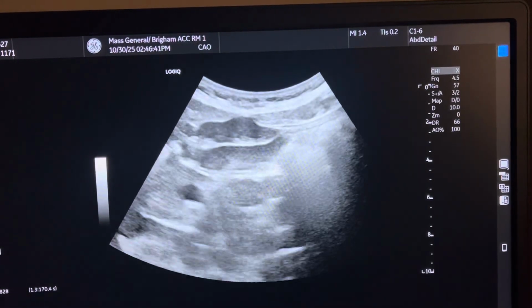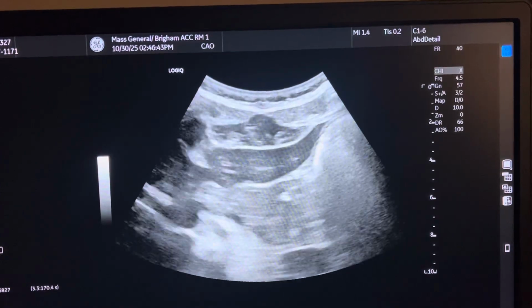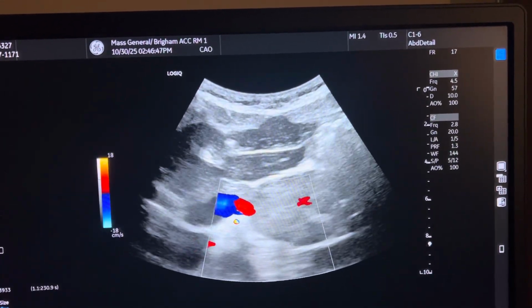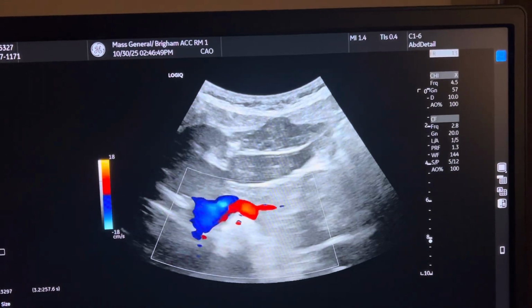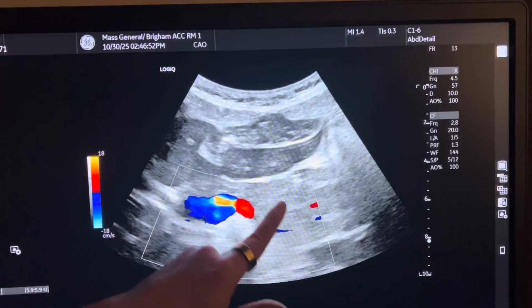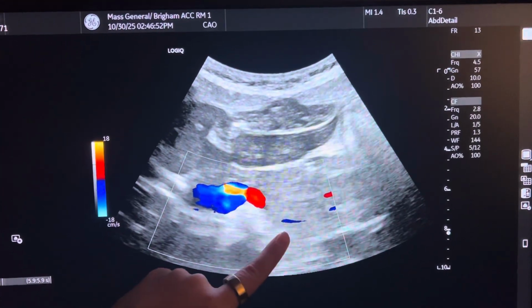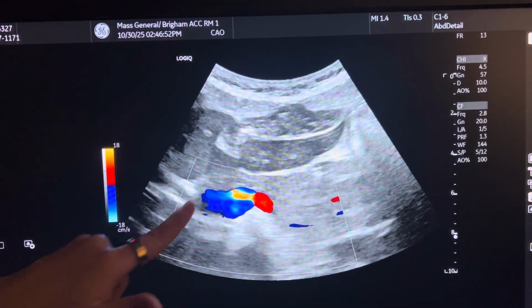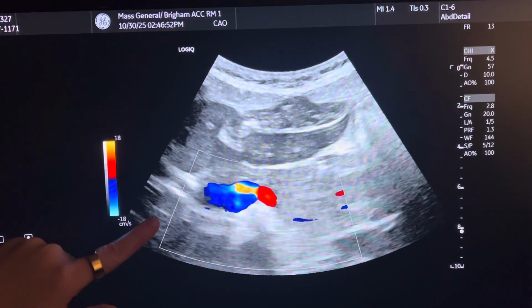The only other one would be splenic vein. I like to get it at the pancreas. Let's see if I can get it. Our patient is not NPO. Oh, but it's beautiful. Look at that. So I am transverse pancreas right now. So this is panc tail, body, head. Your splenic vein is going from your spleen diving into that main portal vein.